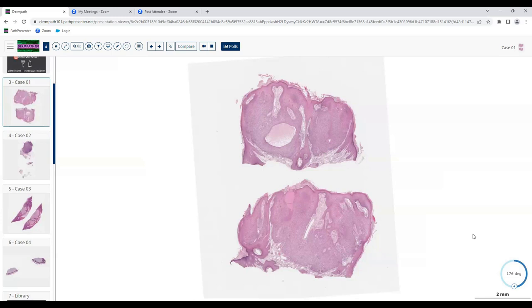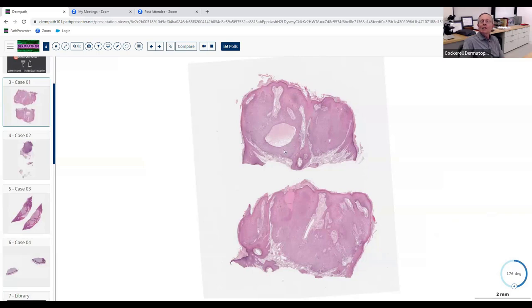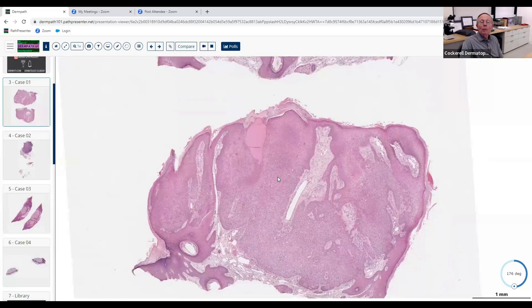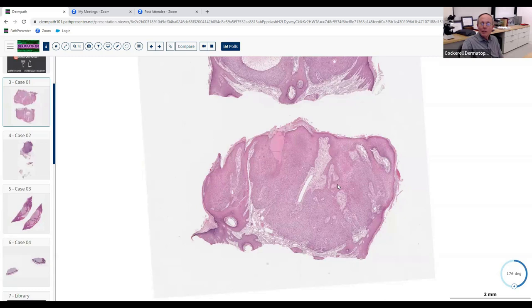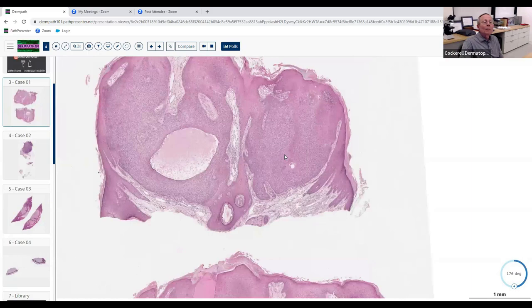I also saw some ductal differentiation with some apocrine secretion. Let's hold on before you go too much further — you said 'what you normally see,' you're probably referring to just the squamous epithelium in the epidermis, correct? So basically you're saying benign neoplasm with epithelial differentiation, which is absolutely correct.